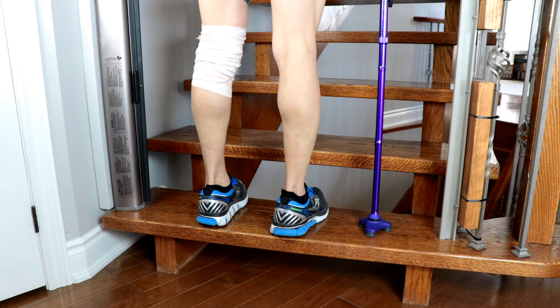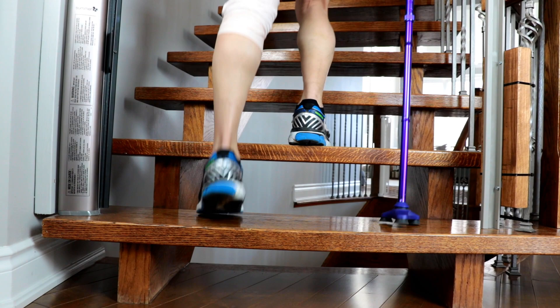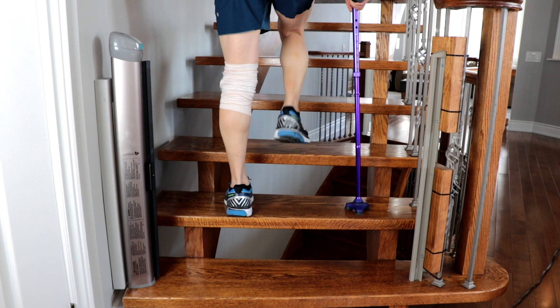Start by putting the strong leg on the first stair. Step onto the strong leg and bring the cane and injured leg up to meet it. This cycle simply repeats until you reach the top of the staircase.